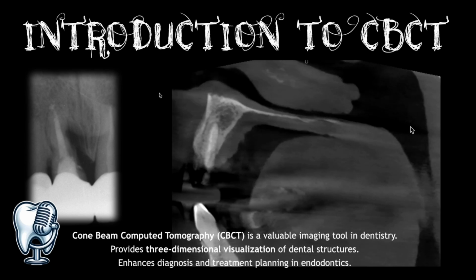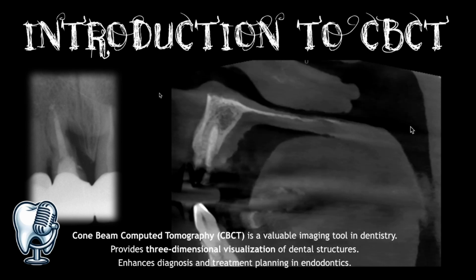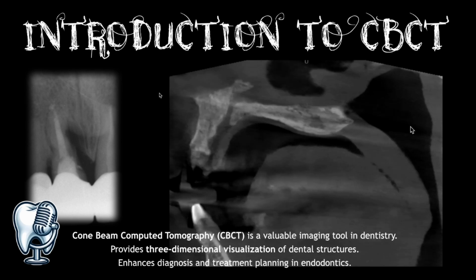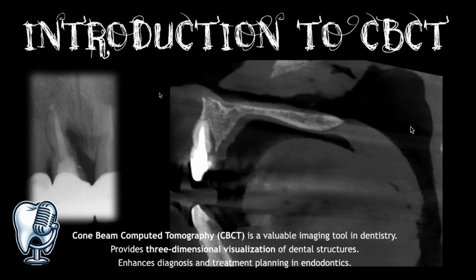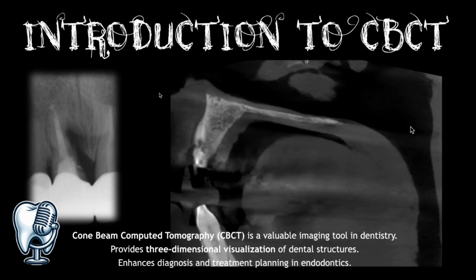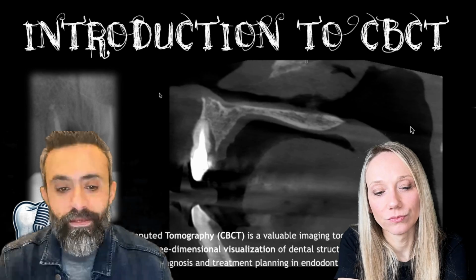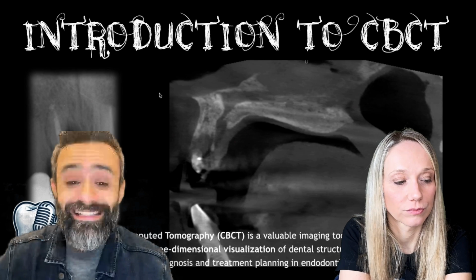Even if you see on the other projection, you see that there is some problem with a tooth that has an endodontic treatment, but I can do apical surgery there. And then we have this Swiss cheese tooth in which I have to try a completely different approach. And that's where CBCT can really help us in choosing what to do for the patient. Yes, I totally agree about that. It's a very valuable tool to get to know what's inside.